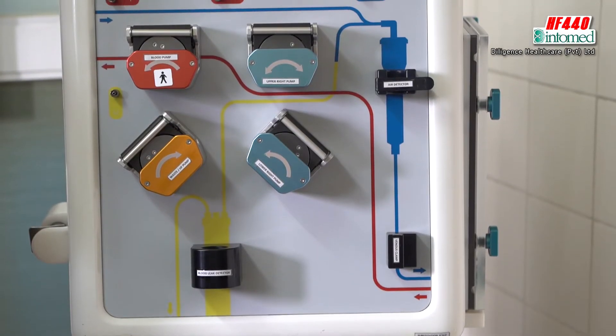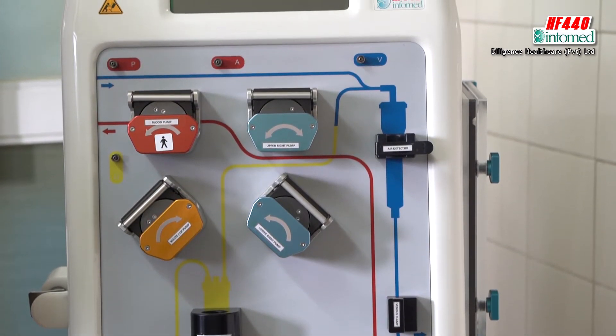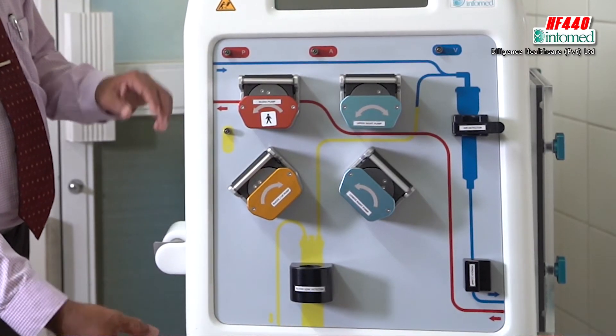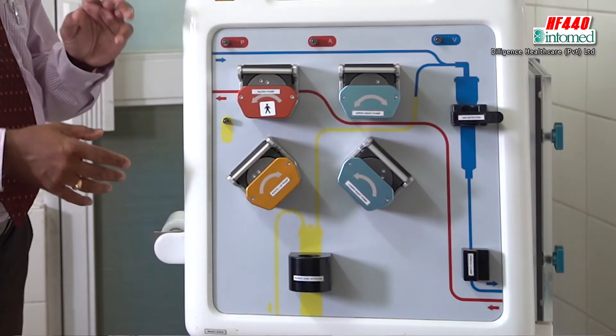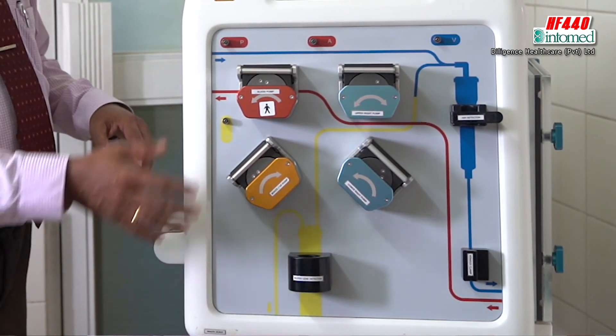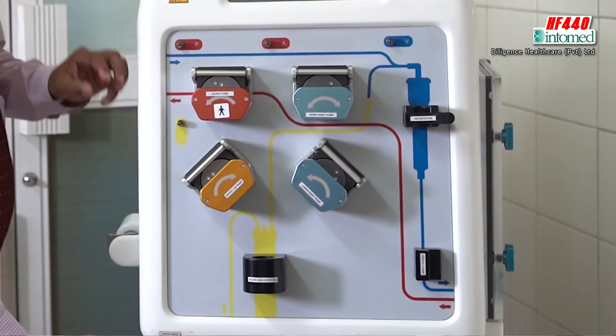Here, the filter connections: there are four connections for CVVHDF and those therapies. For CVVH, only three connections are coming. But mainly you have to keep in mind — four pumps, four segments. The segment is the part of the bloodline that comes here, that is called a segment. Four pumps, four segments, four pressure sensors, and four connections.